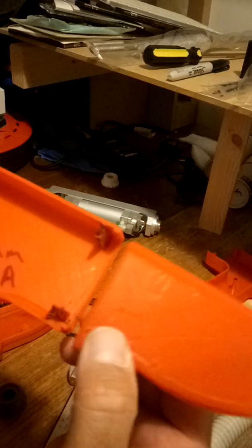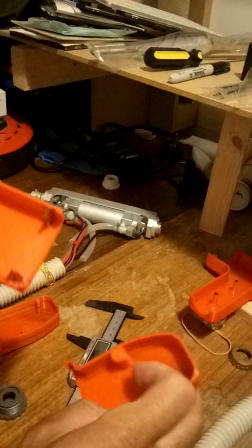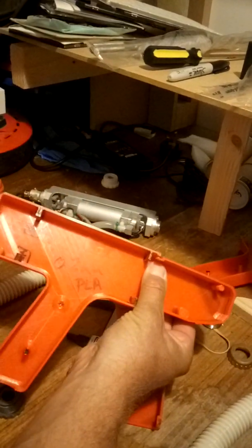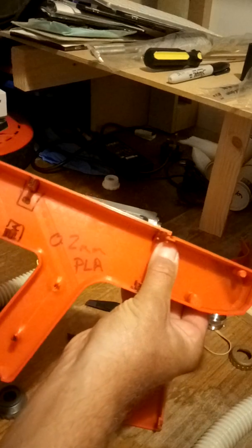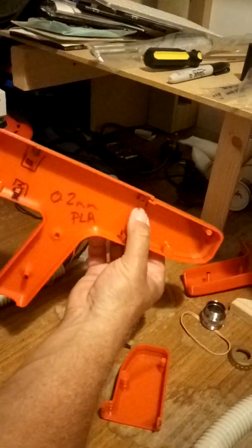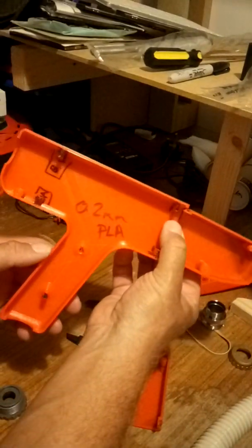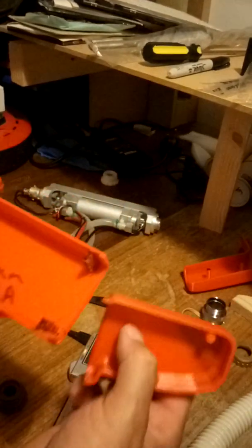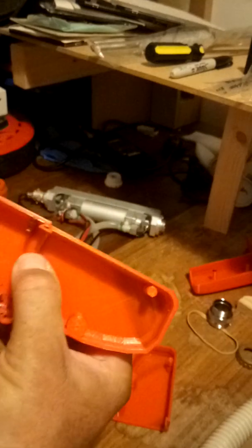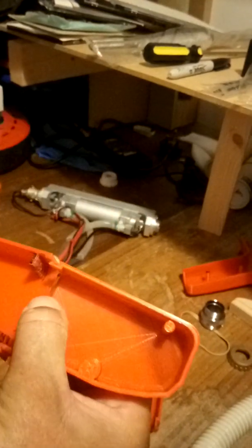The reason why I'm using this is because it's 26 centimeters across when it's complete, like that. That's 26 centimeters from there to there. Now most 3D printers are about 22 and a half, so therefore you cannot print that out in one hit unless you've got a big 3D printer, which I haven't got. So it had to be done in small pieces, but luckily ingenuity and all the rest of it, I think that'll clip on to there, that clips on the top bit, and when it's screwed on properly with that piece up there, look, we should be alright.